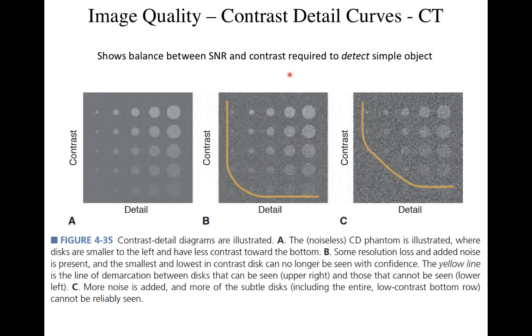This is called a contrast detail curve, which gives you a quick summary, when you look at the picture, of what you can resolve at a given signal to noise. It is organized as follows. Higher spatial frequencies are over here; they're smaller dots. For a specific spatial frequency, or diameter of my disk, you look at different contrasts. These are percent contrasts, so this could be 10%, this could be 1% change.